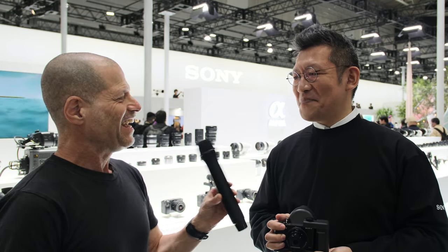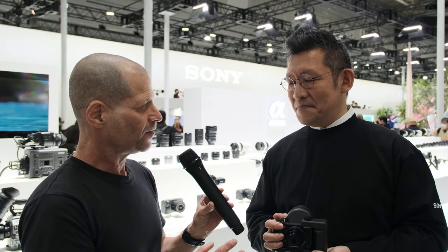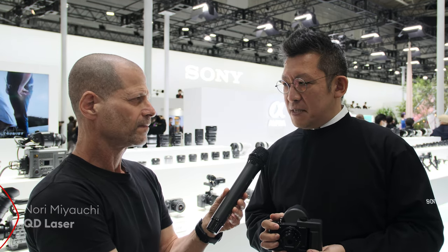I'm Johnny from CineDi and I'm here with Nori-san. We are at the Sony booth, but you are not from Sony. Where are you coming from? I'm actually from QD Laser — a semiconductor laser manufacturer originally founded in 2006 as a spin-off from Fujitsu Corporation.